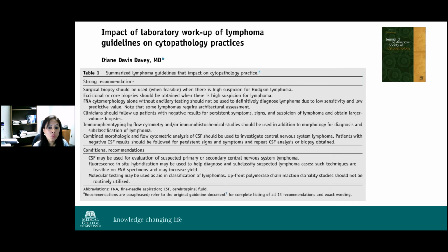Immunophenotyping by flow cytometry or IHC should usually be used in addition to morphology for diagnosis and subclassification of lymphomas. Another excellent article was published in the Journal of the American Society of Cytopathology. This paper summarized the impact of these guidelines on the cytopathology practice, and it essentially reiterated the same points. We are all aware of the increasing complexity of classifying lymphomas. In some cases, it is not even possible on core biopsies to accurately classify the lymphomas. However, as we move more and more towards minimally invasive techniques for diagnosis, fine needle aspiration, touch prep, and core biopsy together with ancillary studies can still help.